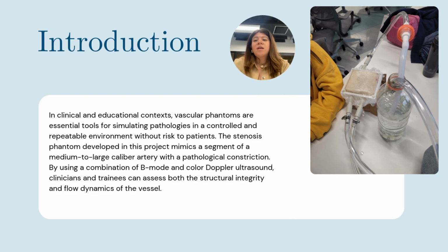In both clinical and educational contexts, vascular phantoms play a critical role. They allow for the safe, repeatable simulation of complex vascular conditions without exposing patients to any risk. Our phantom provides a hands-on tool for ultrasound training, helping users recognize hemodynamic patterns and anatomical changes associated with vascular diseases. To evaluate our phantom, we use two main ultrasound imaging modes.